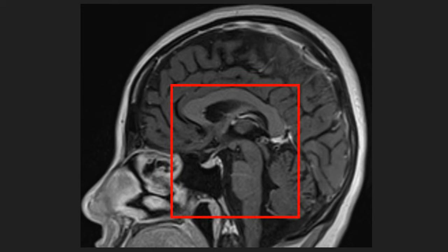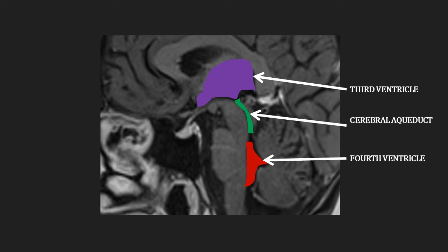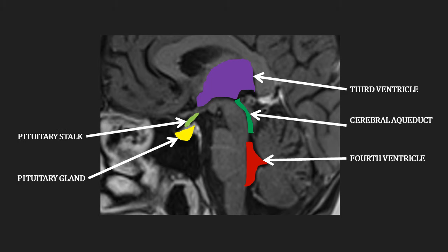Now we will focus on some of these structures in the sagittal plane, as well as look at the pituitary fossa. CSF flows from the third ventricle, through the cerebral aqueduct, into the fourth ventricle. Anterior to this, in the pituitary fossa, is the pituitary gland, highlighted in yellow, and the pituitary stalk is seen above this, highlighted in green. Finally, the optic chiasm lies above the pituitary gland.